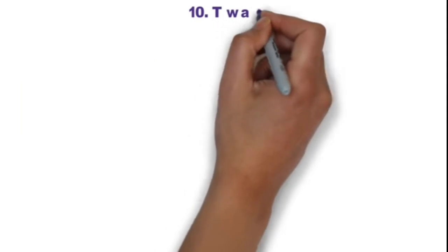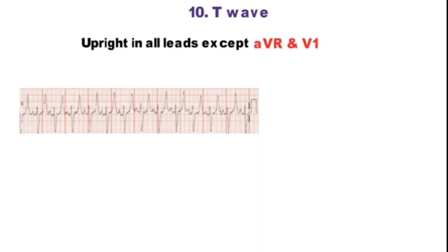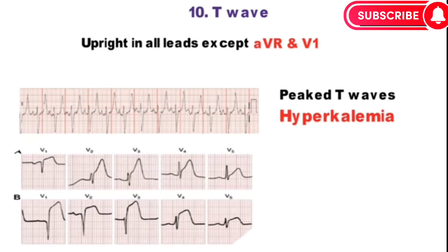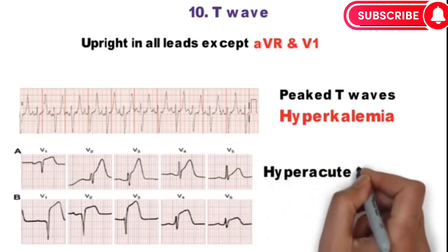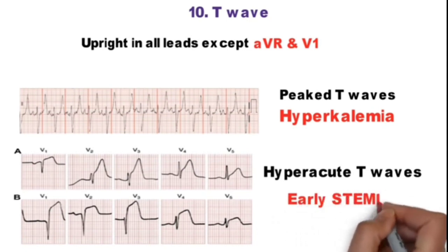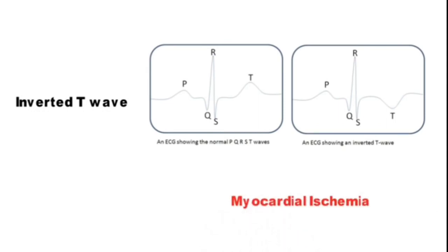Now the last step is T wave. It is upright in all leads except AVR and V1. Tall, narrow, and symmetrically peaked T waves are commonly seen in hyperkalemia. Broad, asymmetrically peaked or hyperacute T waves are seen in early stages of ST elevation MI. Inverted T waves are seen in myocardial ischemia and ventricular hypertrophy.